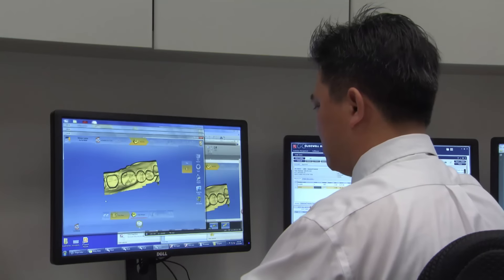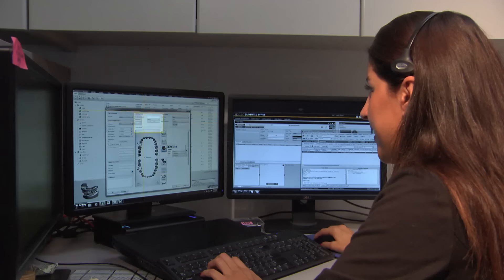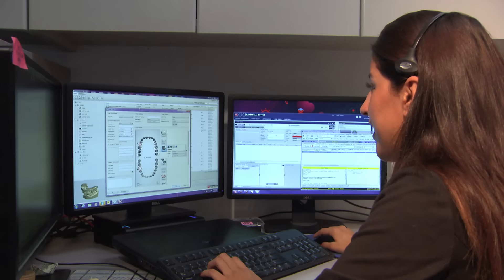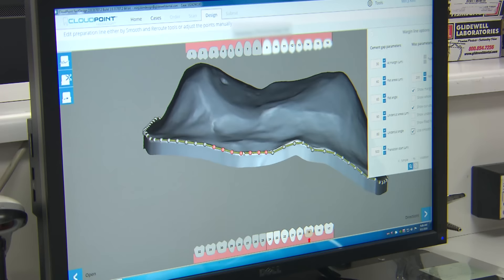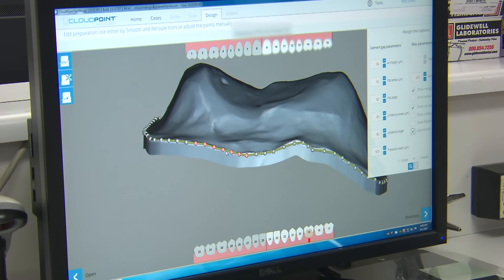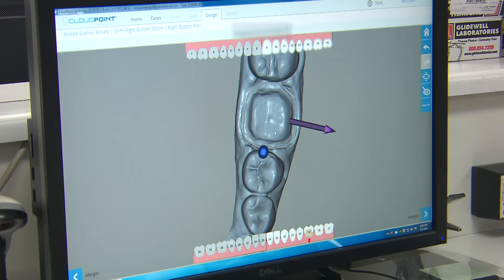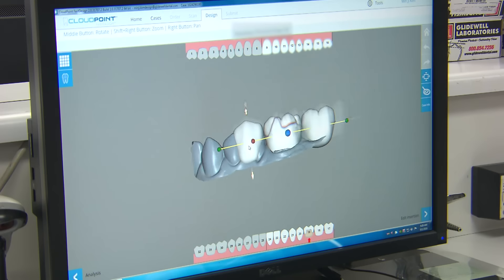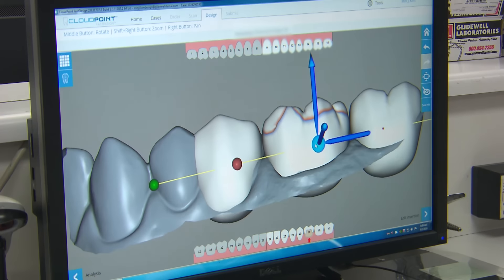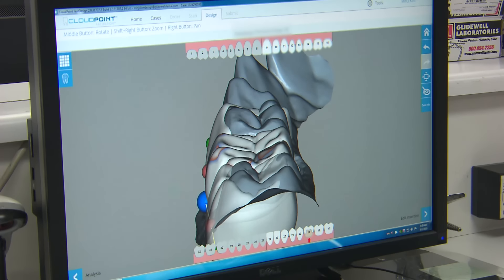When sending digital files to the lab, one of the many skilled technicians in our CDOP department — which stands for Central Digital Order Processing — will evaluate and prepare the scanned data before it is sent into the production workflow. Once the data enters our CloudPoint design software, a technician places the margins and the library design is custom positioned to ensure the proper form and function is achieved for each patient's needs. The technician moves the design to fit the proper functional position with the opposing and also aligns it according to the placement and alignment of the adjacent teeth.